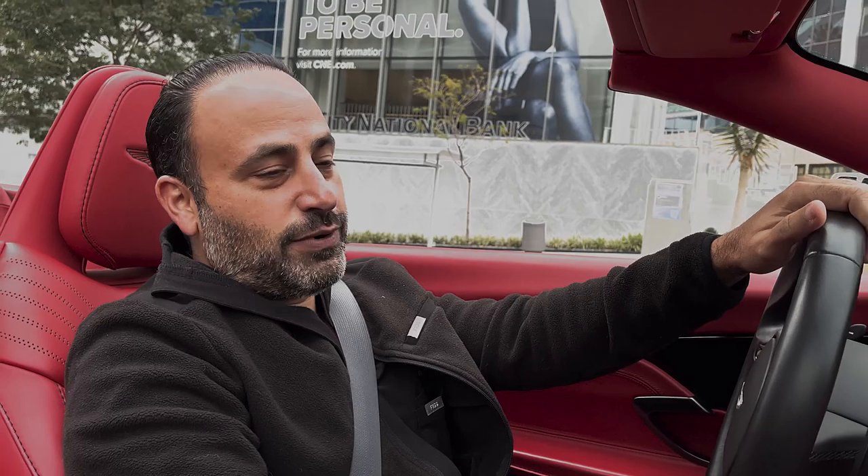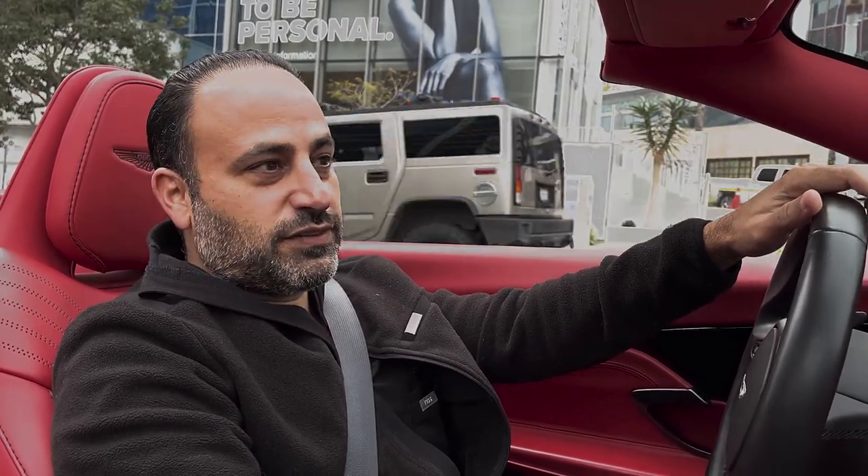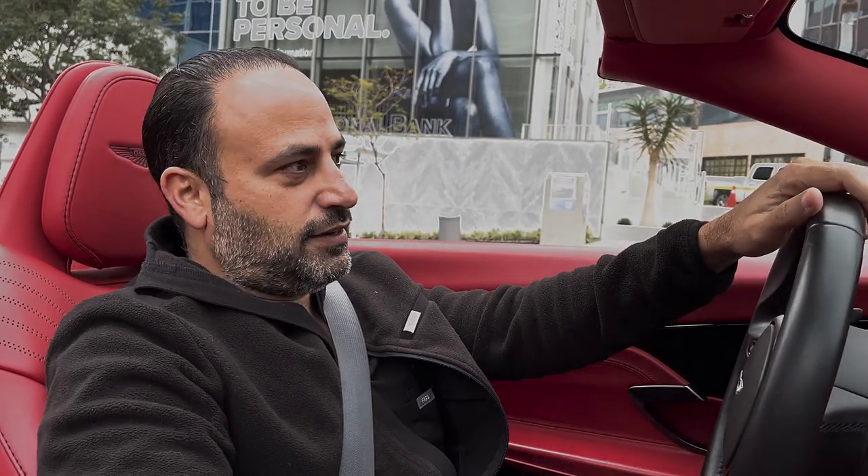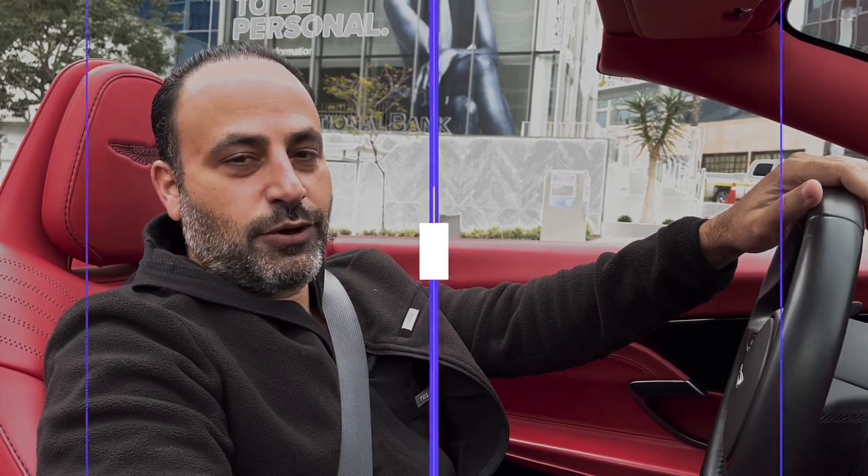This video is for Reveness. We're doing something like a liquid facelift — using filler to make small enhancements around the face without using a lot of volume. You don't want bulky faces, you want them delicate. I love using Reveness and a lot of different products in their line.